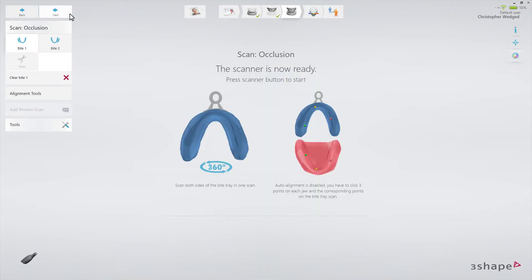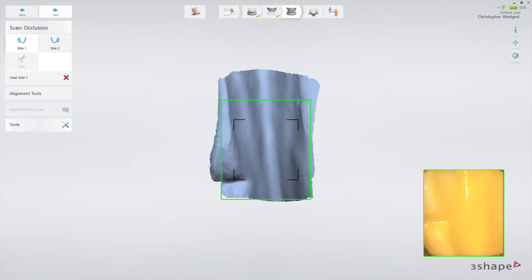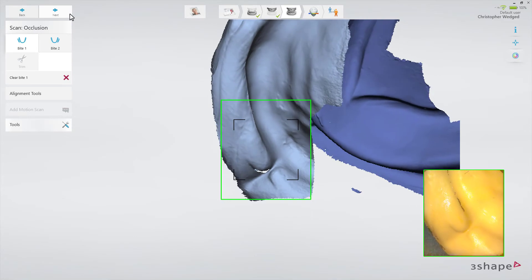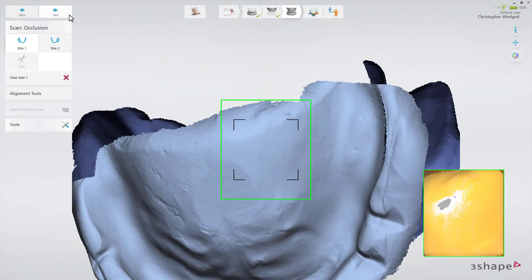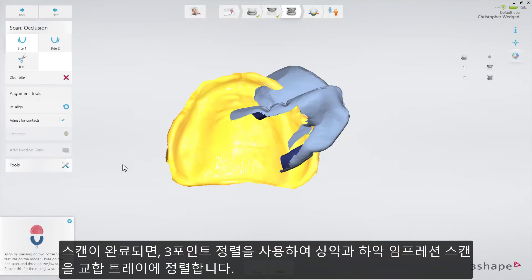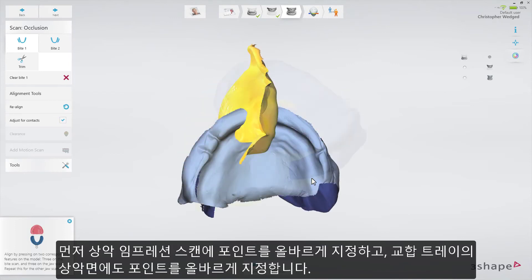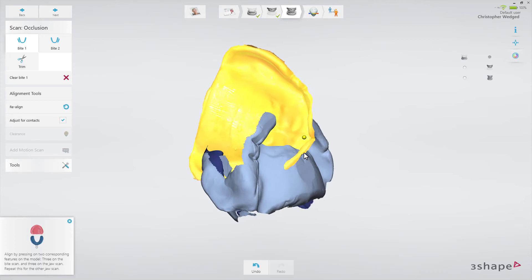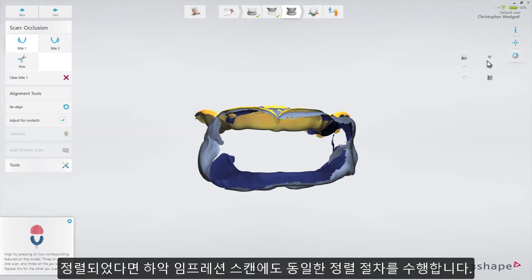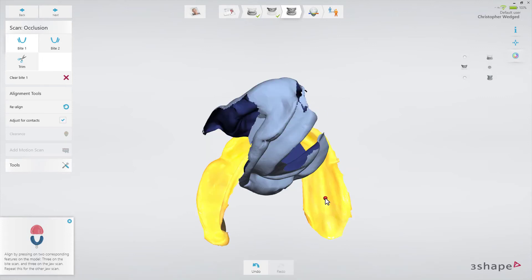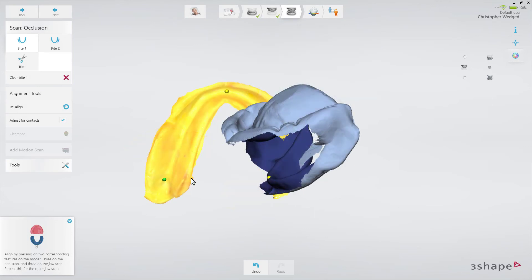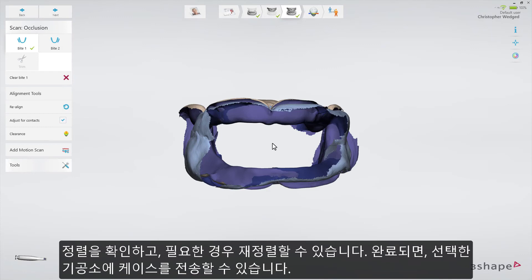Now move to the byte scan page. The pop-up on the screen gives you scanning tips on how to perform it. Scan both sides of the byte tray. When scanning is finished, use the three-point alignment to align the upper and lower jaw impression scans to the byte tray. Start by placing corresponding points on the upper jaw impression scan and the upper jaw side of the byte tray. When aligned, perform the same for the lower jaw impression scan. When the alignment is done, you have the possibility to realign if necessary.